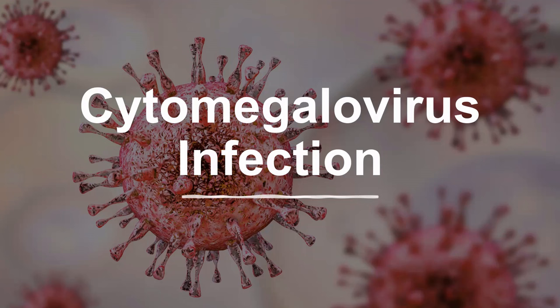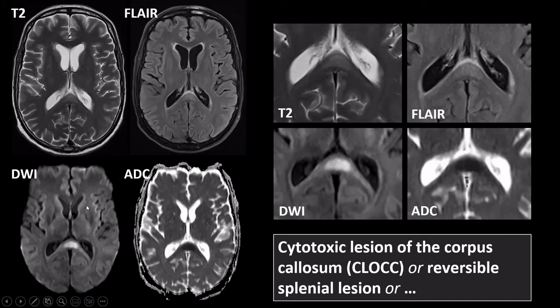Cytomegalovirus is rarely the cause of central nervous system infections in adults, and when it does, it will do so in patients with severe immune suppression. On these images we see T2, FLAIR, diffusion-weighted images, and the ADC map. We see a faint signal increase centrally in the splenium of the corpus callosum — a bit hazy on T2 and FLAIR, but clearly visible on diffusion-weighted images and the ADC map as diffusion restriction. This entity has many names: transient splenial lesions, reversible splenial lesions, or cytotoxic lesions of the corpus callosum.